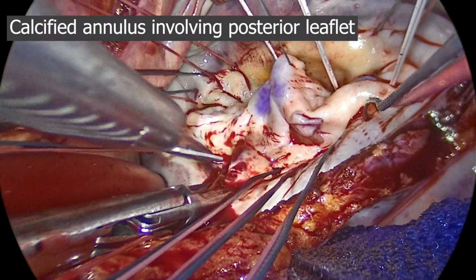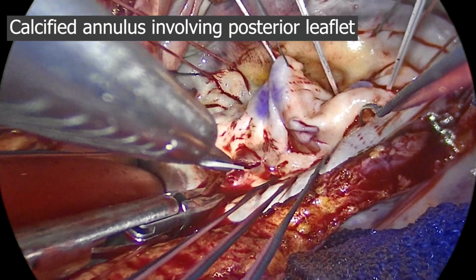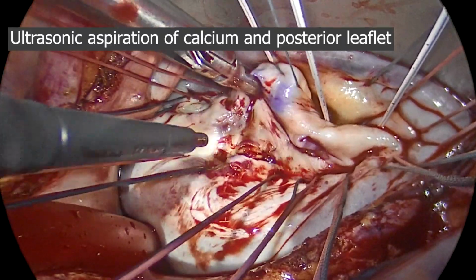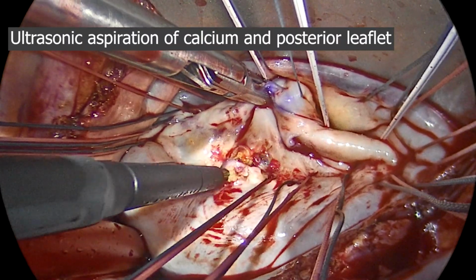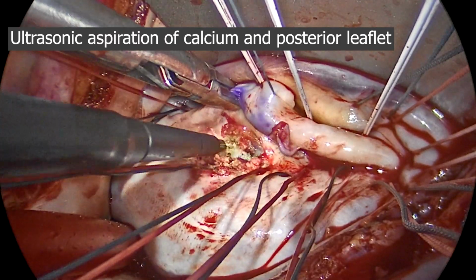We detach where the annular calcification is at the base of the leaflet. This will prepare the annulus and leaflet for ultrasonic aspiration, which will improve the mobility of the leaflet. Once the posterior leaflet is detached, ultrasonic debridement is used to carefully remove the calcium deposits from the posterior leaflet. This allows us to remove calcium that is restricting leaflet movement and will help ensure better coaptation and reduction of calcification progression.